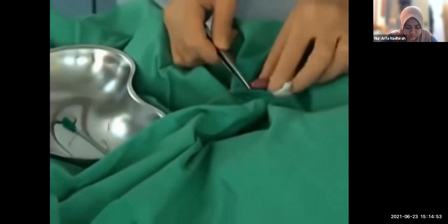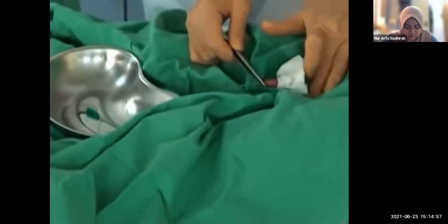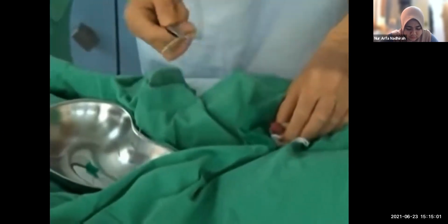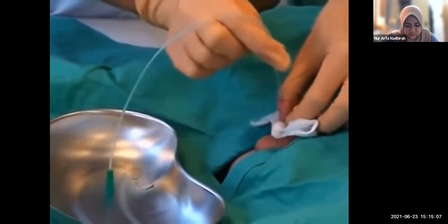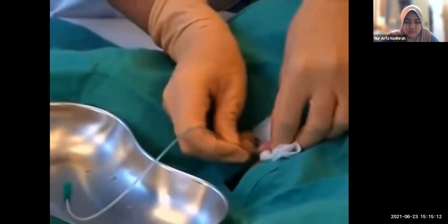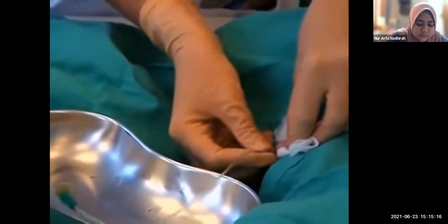After the catheter has entered the bladder, urine should drain through it into the container. When urine flow has ceased, remove the catheter and send the urine for culture and urinalysis. If a foreskin is present, gently pull it back over the glans to prevent the development of a paraphimosis. We will now show the insertion technique without the use of forceps. After finishing a sterile prep and positioning the child, hold the lubricated catheter with the fingers of your dominant hand. Insert it through the urethra and into the bladder using the same technique as previously demonstrated.